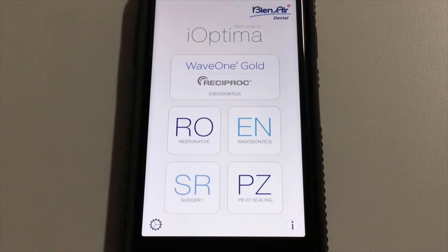This is the home screen of the iOptima system. For the purposes of this demonstration, I'm using this on my cell phone rather than a unit that is currently connected to a delivery system. For those interested in playing with the interface, you can go to the App Store on your Apple device and download the iOptima app for free. As you can see on the home screen, there are five different programs which are currently enabled with my iOptima system.